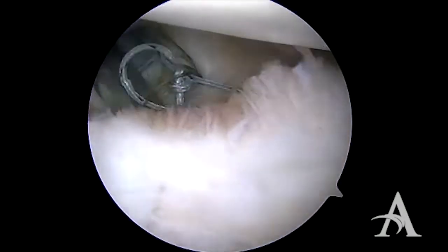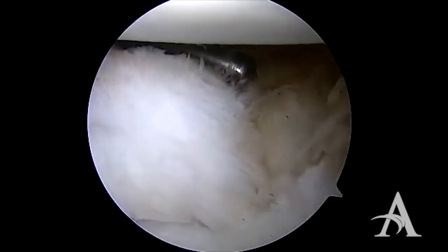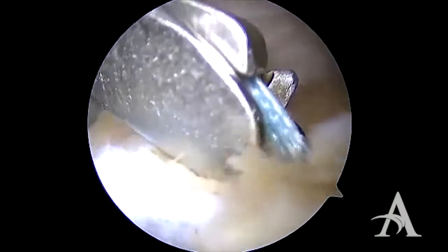We use a sliding locking knot followed by half hitches. The sutures are then cut.